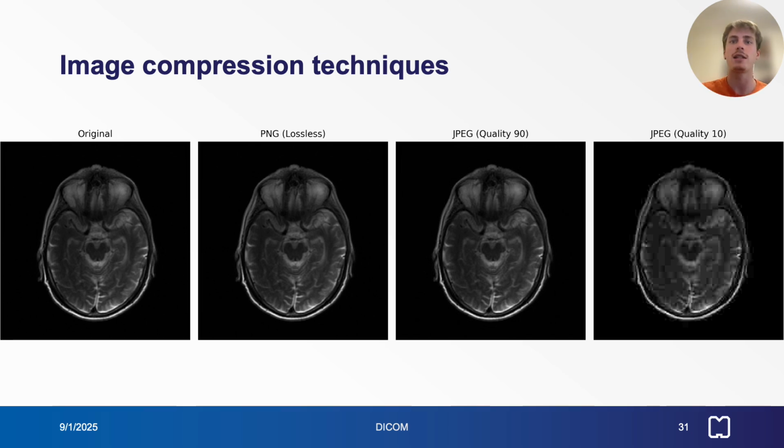Compression techniques transform data to expose redundancy and encode it compactly using methods like Huffman encoding, dictionary coding, or run-length encoding. Image-specific techniques leverage spatial and color redundancy, such as encoding pixel differences or transforming RGB channels into luminance and chrominance channels. Advanced transformations like frequency or wavelet domain encoding further optimize compression by compactly representing image data.